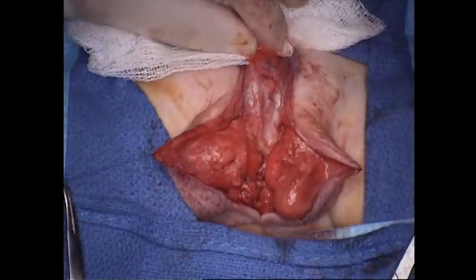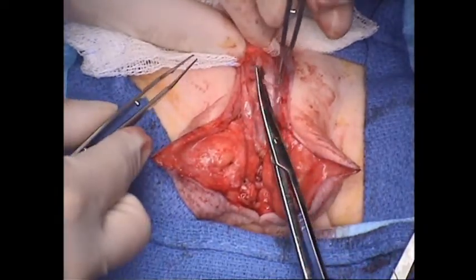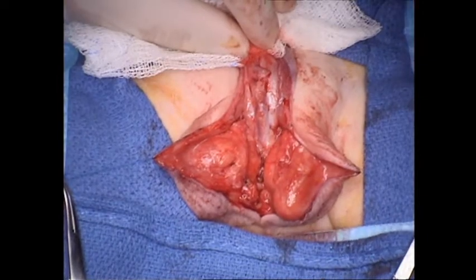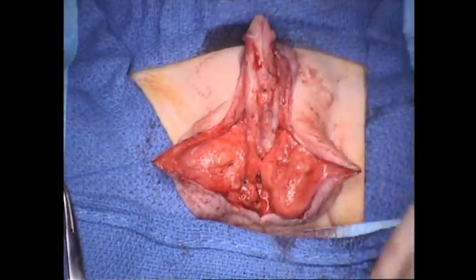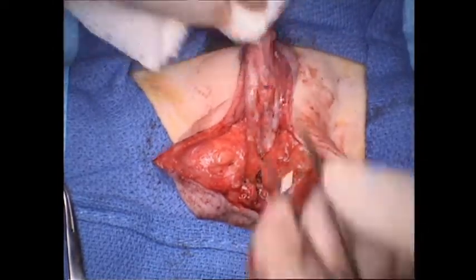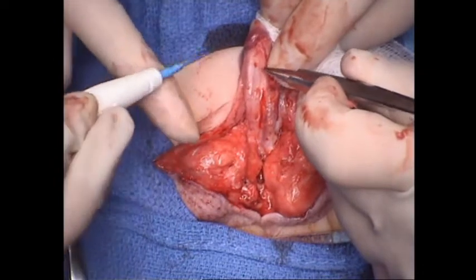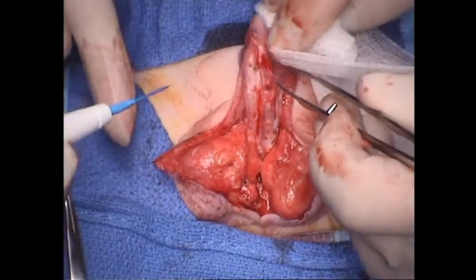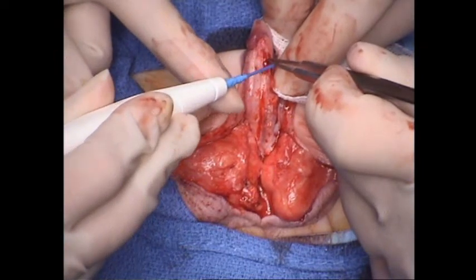So when it comes to ventral curvature, there's three reasons that the penis can be curved. Number one are tethering skin and dartos tissues. So that's what we're in the process of dissecting now. We've removed any tethering skin tissues. We're removing any tethering penile or scrotal dartos tissues. And after we do that, then we'll check the artificial erection.